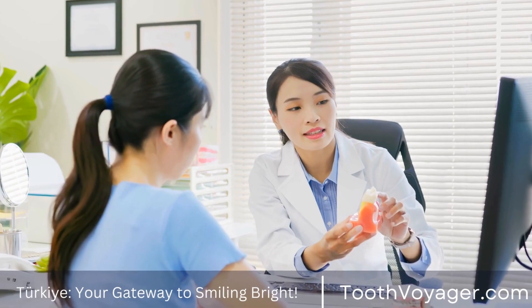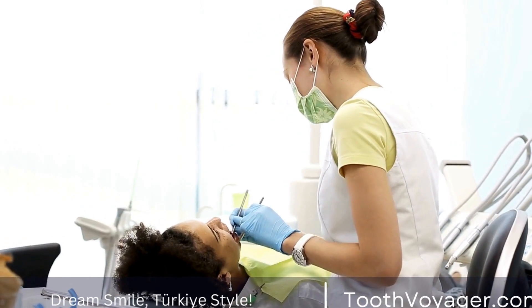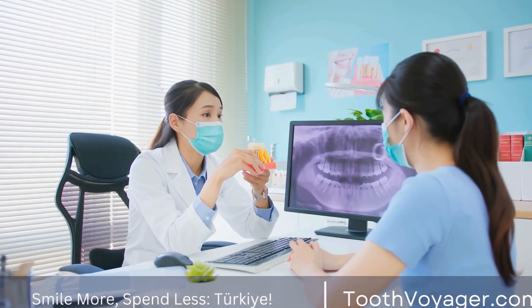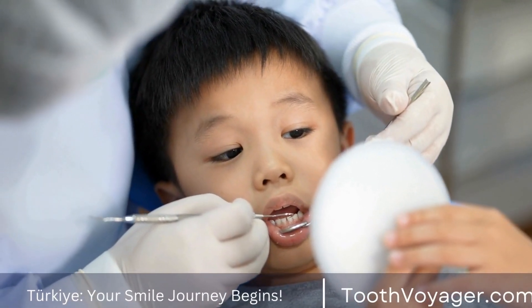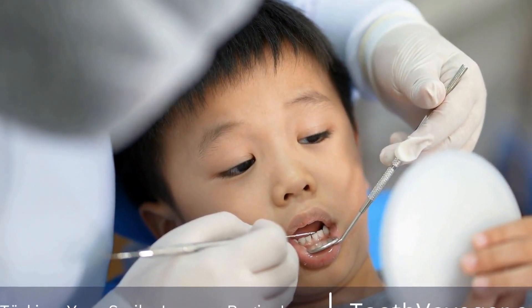The process of creating dental veneers begins with a consultation with a dentist. During this initial appointment, the dentist will assess the patient's oral health and discuss their goals for their smile. The dentist will take impressions of the patient's teeth to create a mold that will serve as the basis for the design of the veneers.